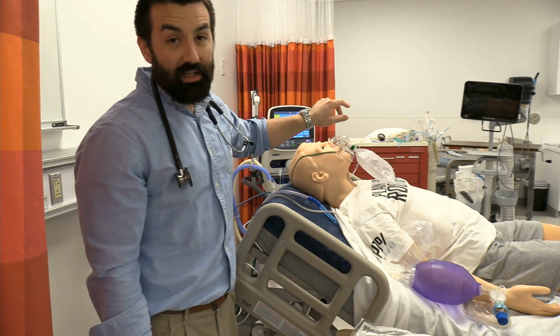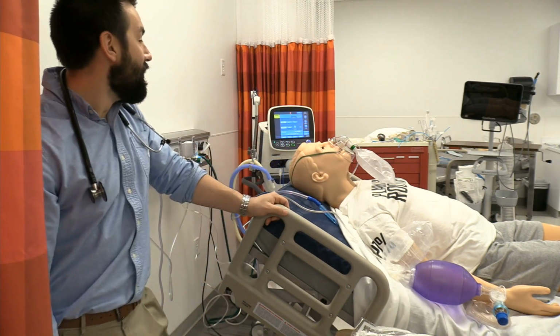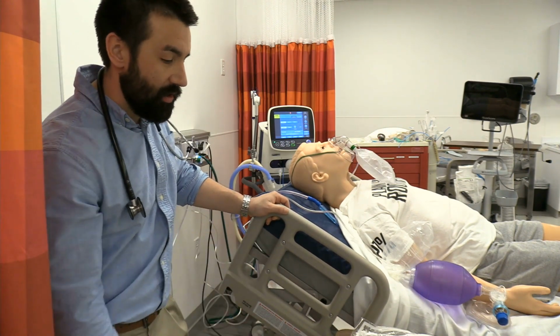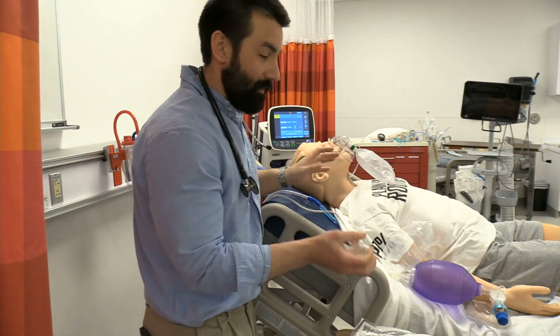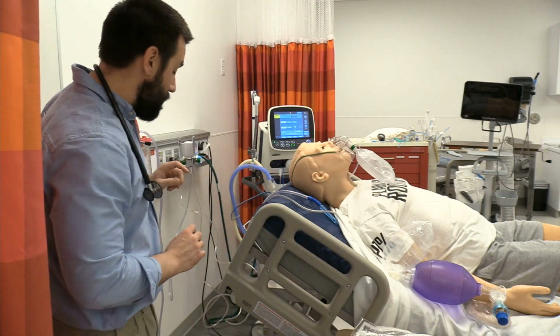I have a lot of things on my airway cart. We got video laryngoscopy if this physician struggles getting that tube into the promised land here. Ideally, we'd have multiple other people in the room that would be able to go fetch me supplies should they be needed. So I'm going to leave stuff on the table. Once again, clinically, I'm usually putting stuff in my pockets. I lose a lot of things in the bed, and I don't want that to happen here.